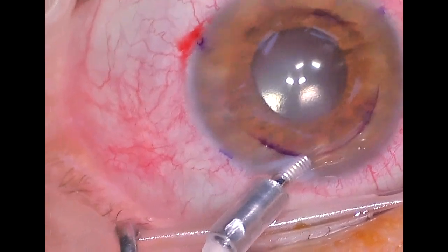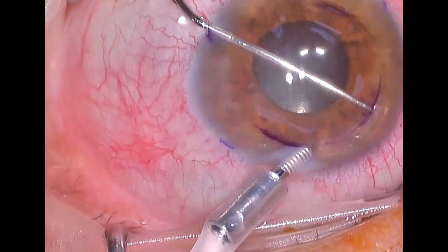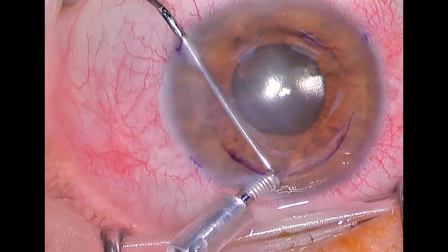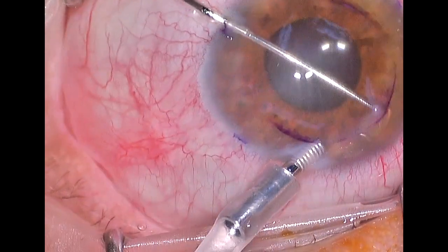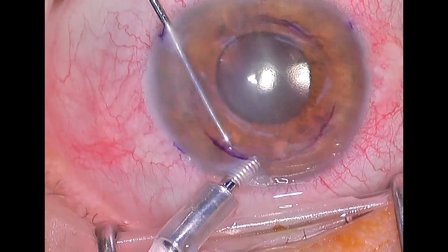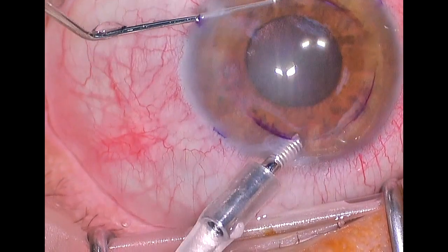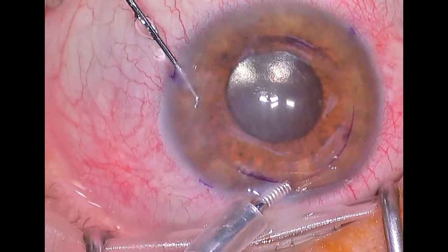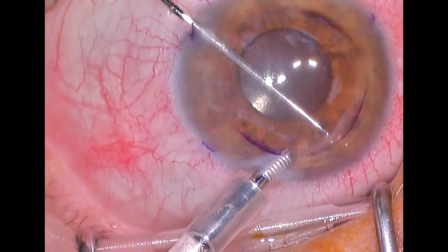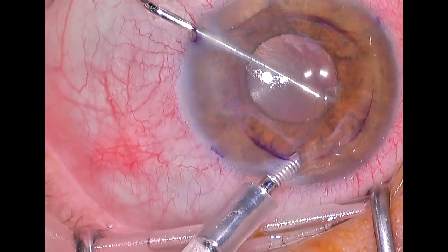Once the anterior chamber maintainer is in place and all the side port incisions have been created, we use a reverse Szynski hook to score the endothelium. We score it along the eight millimeter mark internally, and in this case the endothelial tissue that we are removing is quite thick. Once it's scored and we begin to scrape it, you'll be able to see the edge come away from the internal part of the cornea.